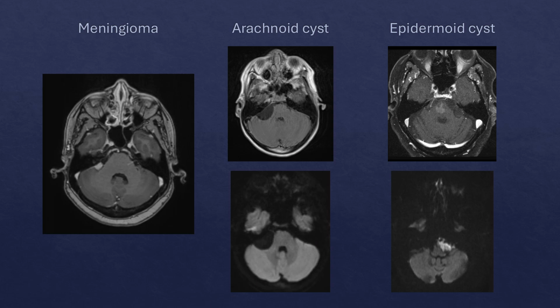Another good teaching point to remember is that if you see bilateral schwannomas, think about neurofibromatosis type 2, which can present with multiple schwannomas, meningiomas, and ependymomas. It's also good to keep in mind that often with test questions and with RadExam questions, they are looking for the best answer choice. It is often possible that other answer choices may present similarly, but are less likely. So always try to pick the best option given the imaging and clinical history that you are provided.